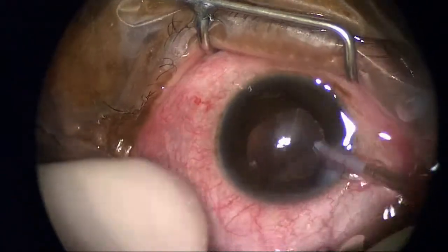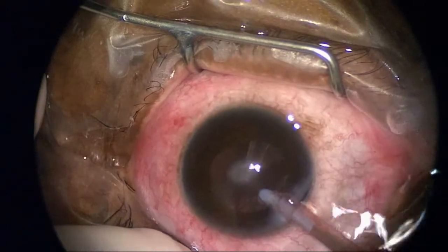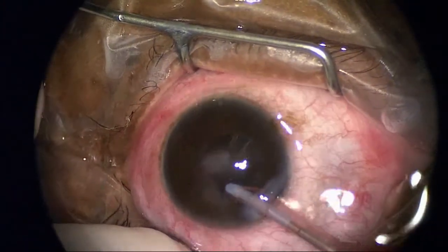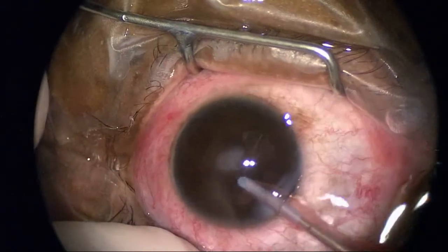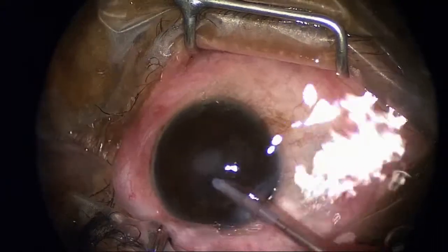This is the residual cataract material that I remove in preparation for inserting the intraocular lens. I want to make sure I've got all the lens material — all the cataract — out of the patient.